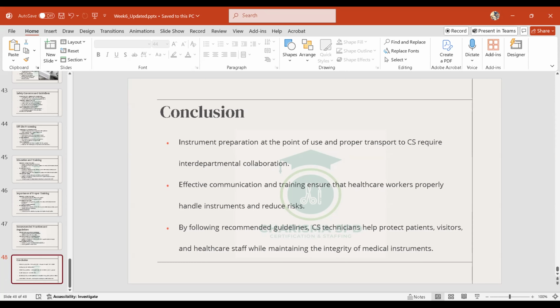You don't get cuts or injured. The process runs smoothly when you remove gross soil. Instruments don't dry up, so it takes a shorter time to process them. Cases are not delayed and patient outcomes are great. Patients get better service because instruments arrive on time and they are not kept on anesthesia for a very long time. When we follow the guidelines, we are able to do that.